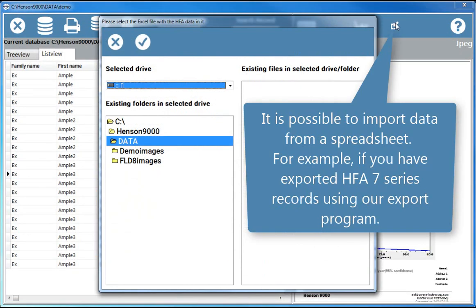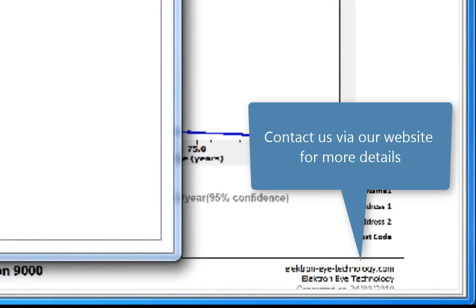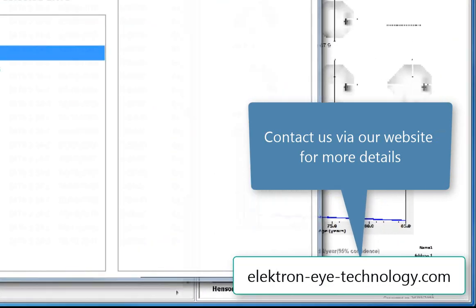It is possible to import data from a spreadsheet, for example, if you have exported HFA 7 series records using our export program. Contact us via our website for more details.